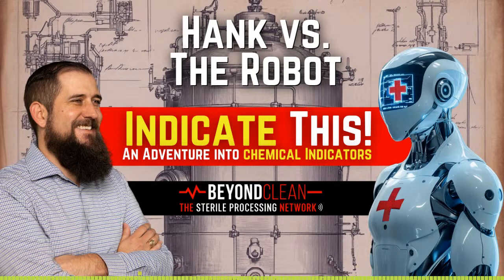Now, a chemical integrator takes things up a notch. It's the detective on the case, looking at multiple factors like time, temperature, and the presence of a sterilant. These are class 5 indicators under ISO standards, and they mimic biological indicators in how they respond to sterilization conditions. They're much closer to verifying actual sterility, not just exposure. Integrators live inside the pack, ensuring conditions were met in the toughest spots. To put it simply, indicators ask, did we start the race? While integrators confirm, did we cross the finish line? Both are valuable tools, but they play very different roles in the SPD workflow.